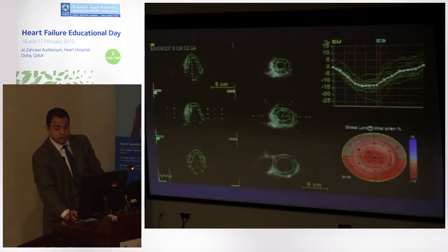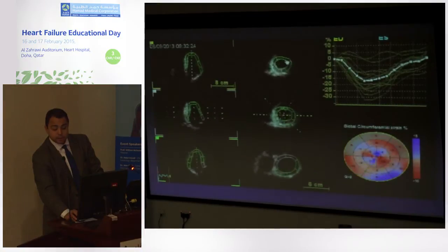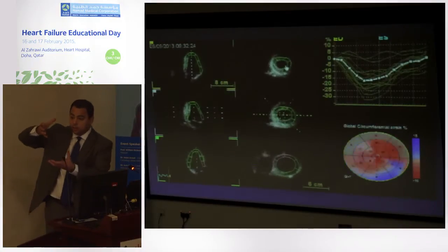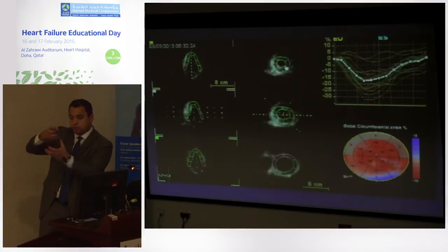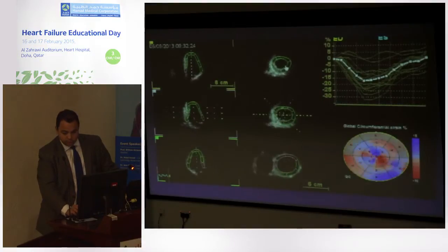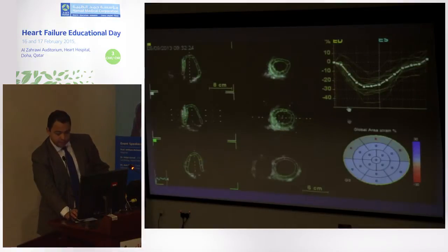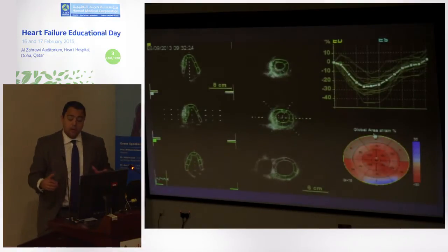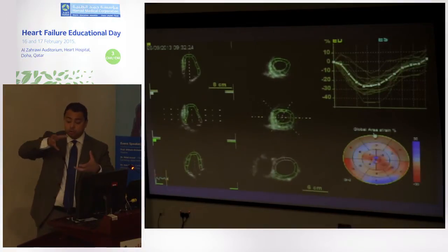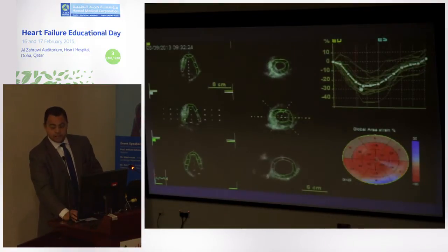The other thing that three-dimensional imaging allows us to do is get global circumferential strain. Longitudinal strain is the deformation up and down. Circumferential strain is rotational strain. We know that the LV, when it contracts, yes, the length shortens, but it also twists towards a centroid. So there's a circumferential rotation there. His circumferential strain is abnormal. It should be more negative than negative 20. But the one thing that three-dimensional imaging allows us to do is get area strain, which is a combination of longitudinal and circumferential. His area strain was negative 26, and negative 40 or less is normal.